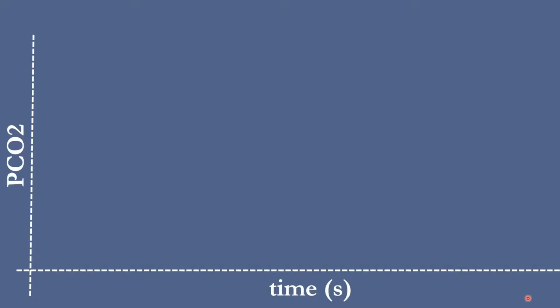Now let's just look at the waveform in depth. So this is time-based capnography, which is the same capnography that all of us have on all of our patients in the unit, or at least hopefully have. To go through the steps of the waveform, phase 1 is a combination of inspiration, so there's fresh gas entering and there's no CO2 returning to the sensor. That kind of makes sense. The very end of it, though, is probably the beginning of exhalation, but you don't see it because the initial dead space gas that comes back will be CO2 poor.